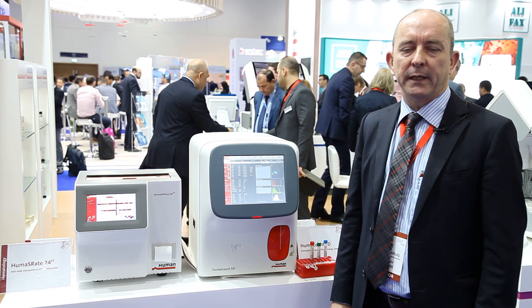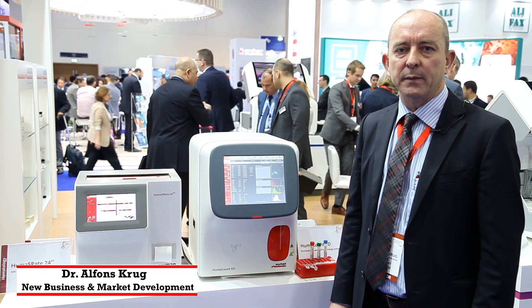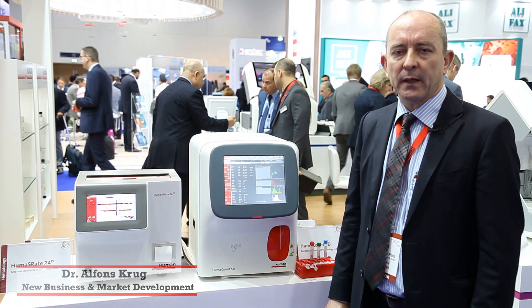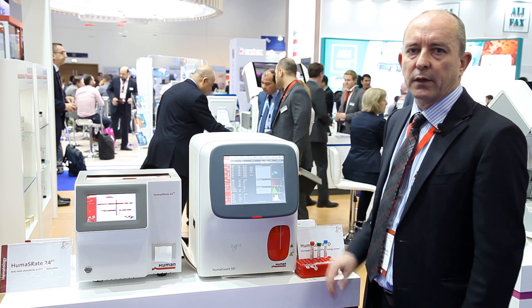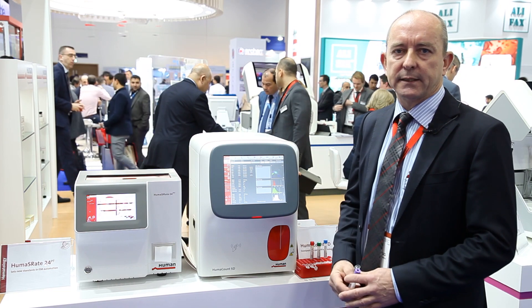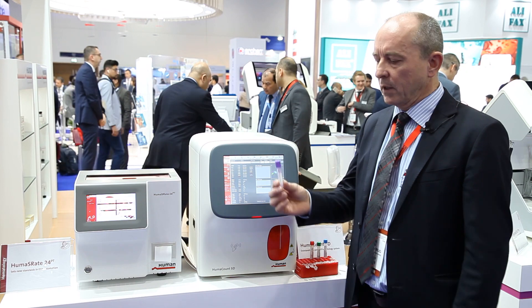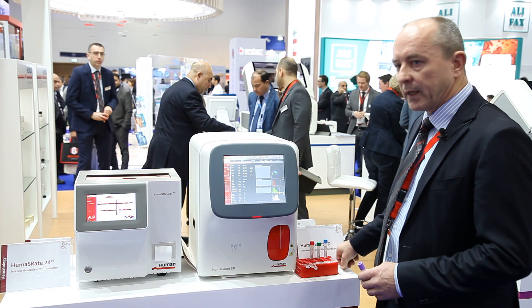Hello, welcome everybody. My name is Alphonse Krug. I'm the product manager of the hematology line of HUMEN. We are a German company, and here I would like to introduce you to the HUMACCOUNT 5D, which is a five-part analyzer. It has the nice function that it works not only on EDTA tubes but also on capillary tubes.